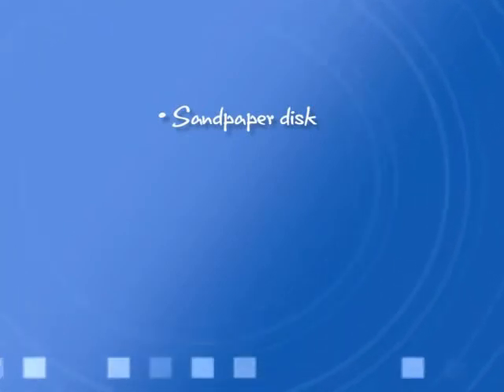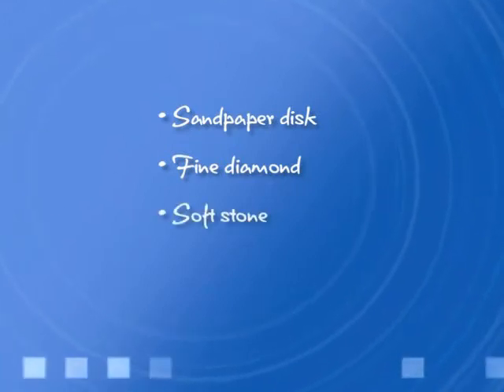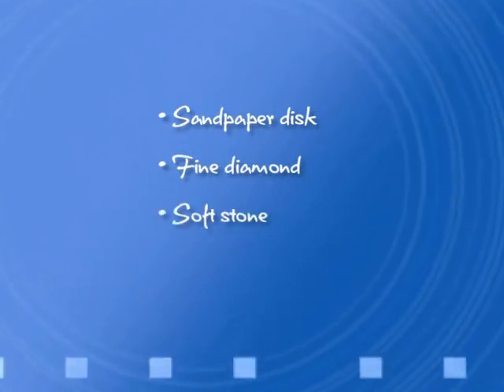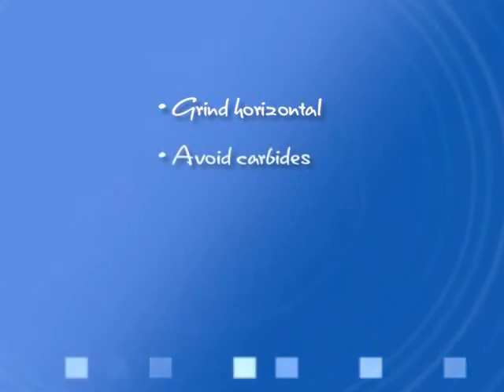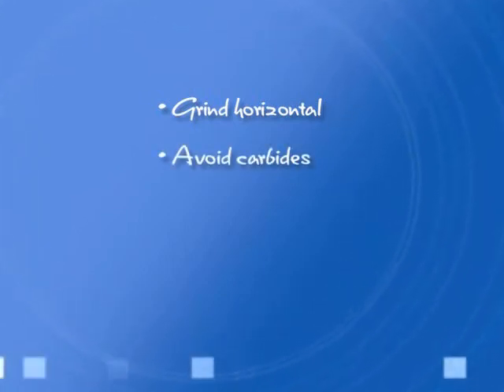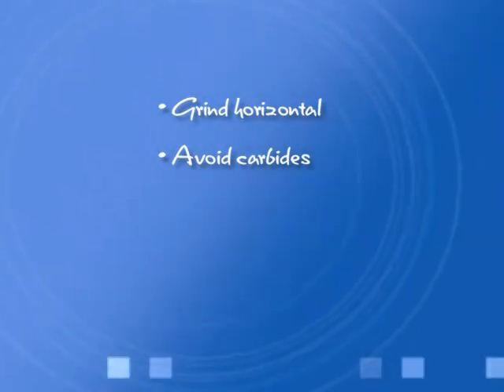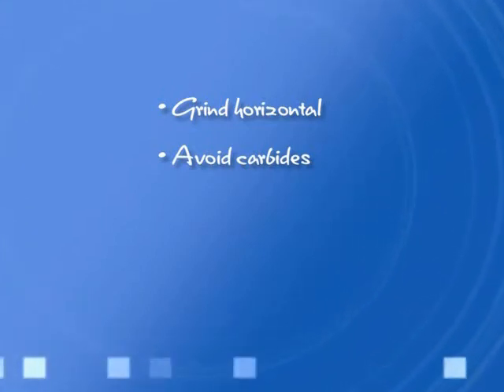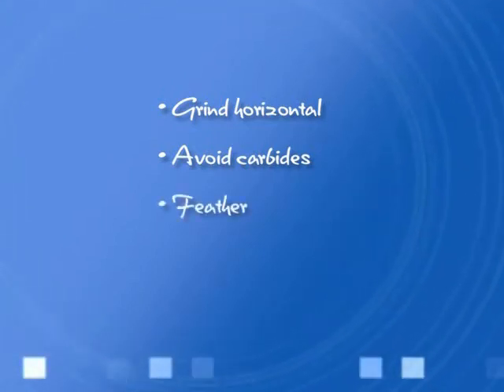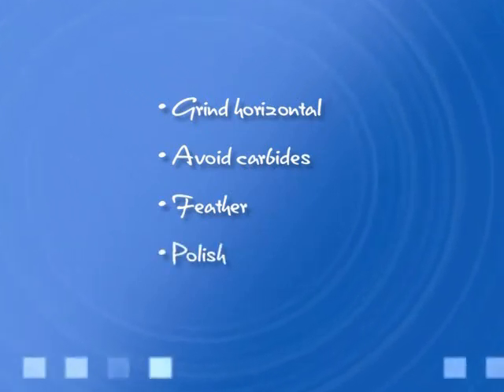You may shorten the crown by using a sandpaper disc, fine diamond, slow speed, soft stone, green or white, or a coarse rubber wheel. You should grind horizontal to the composite metal junction. As with all composites, carbides should be avoided, as they can set up fracture lines. If you shorten the facial, you will lose the facial crimp, so you may have to compensate on the lingual crimp. After shortening, you may also feather the composite at the margin if needed, and polish as you would any other composite.